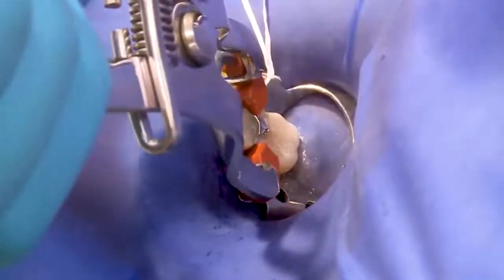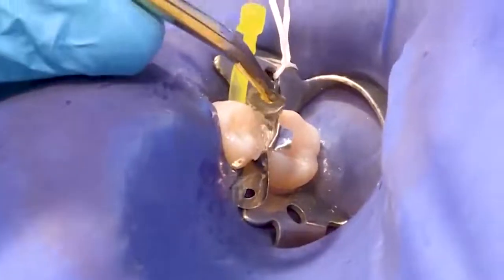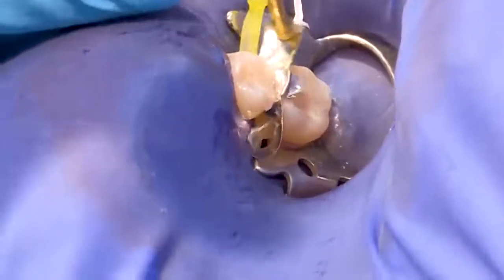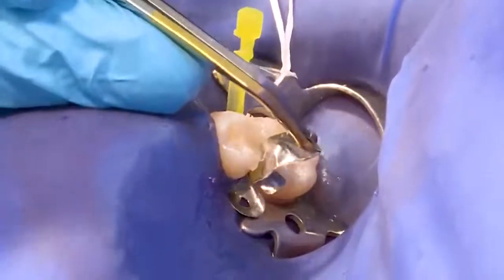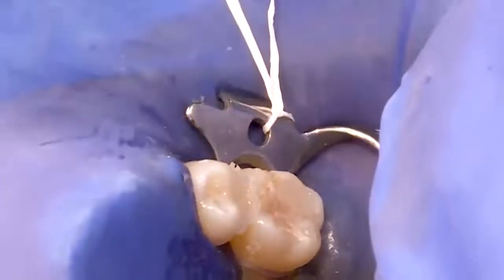Once the restoration is complete, remove the ring, wedge, and matrix. A firm gripping instrument, such as the Halo pin tweezer, oral hemostat, or cotton pliers, may be needed to remove matrix due to the tight interproximal contact achieved with the Halo sectional matrix system.